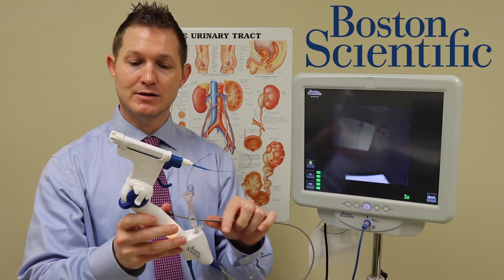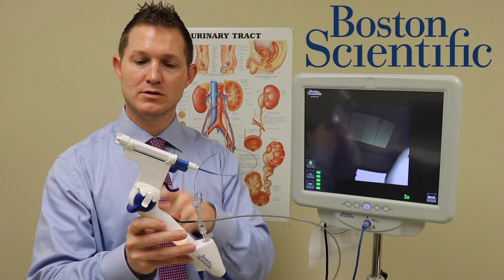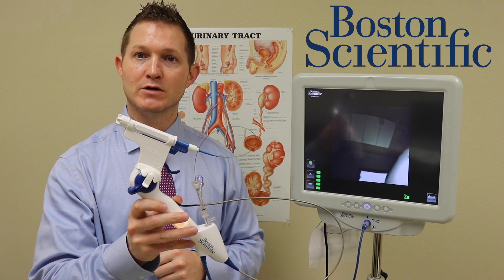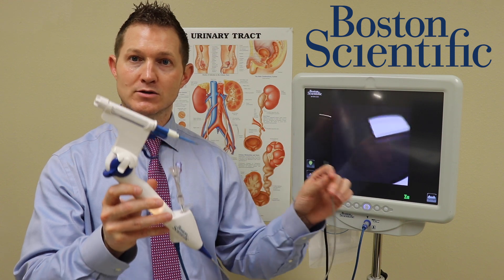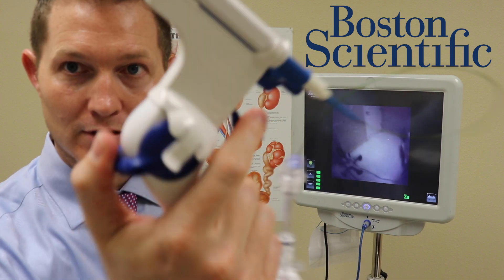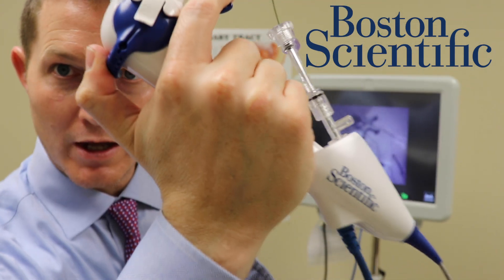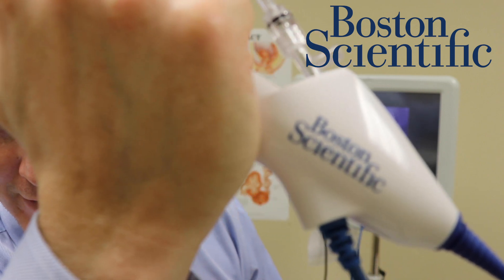Commonly a second operator of the basket would be used, since no other scope has the Empower device to allow a surgeon to operate the basket with one hand — in fact, even with the same hand as the scope. Boston Scientific has made that possible for us.